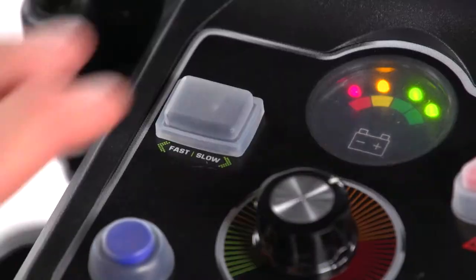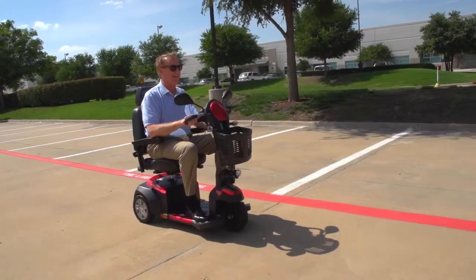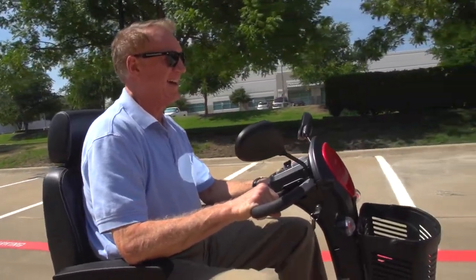Parking lights, fast/slow switch, hazard switch, and dual rear view mirrors for even greater safety. You can always count on Drive Medical to bring you convenient and innovative lifestyle solutions now and for the road ahead.